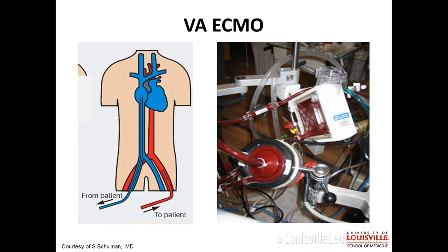And remember at the beginning I said that one of the goals of mechanical support is to offload the left ventricle that needs to heal. ECMO loads the left ventricle because I'm delivering the blood into the aorta and it retrograde fills into the ventricle. So this is actually a volume load, which is not great for the myocardium. But sometimes you have to, and we don't have any perfect therapies. So that's all I'll say about ECMO, but it's a good back-pocket trick that I've used in dire circumstances, both for pulmonary reasons and for cardiac reasons.